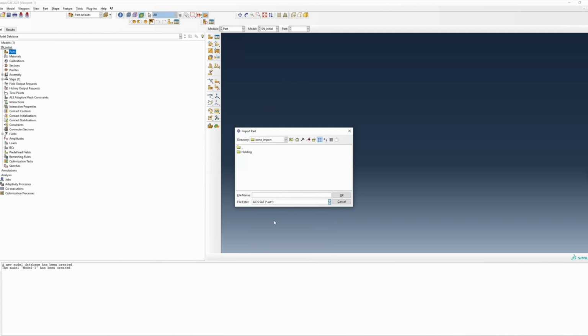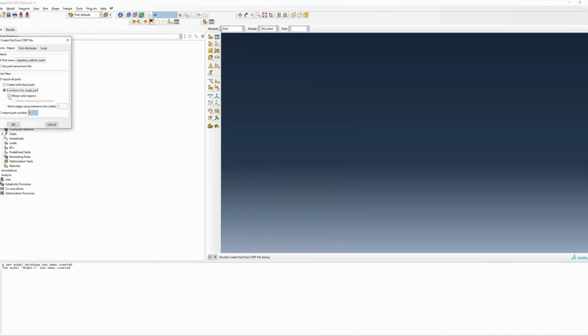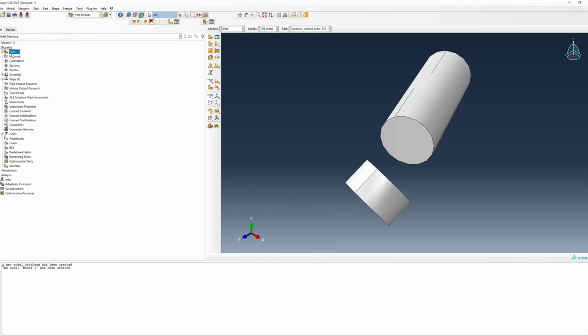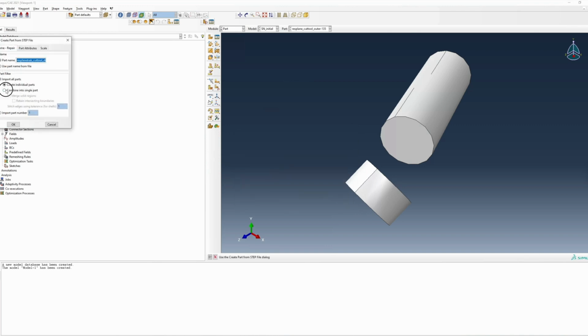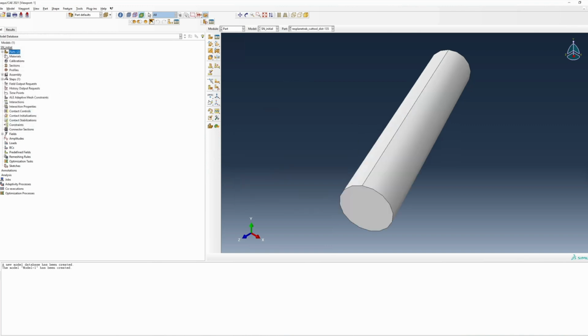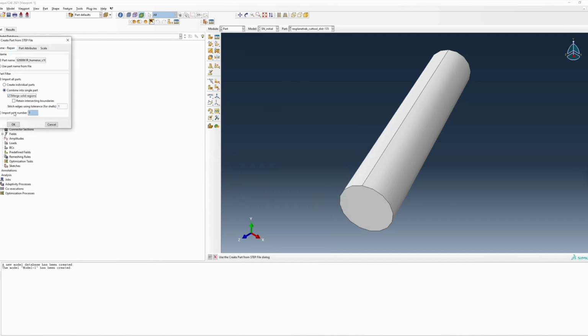To start off, just import your step files for your bone models as well as your cut tools. It's important that you use discrete geometry cut tools in Abaqus directly as opposed to performing your resections in SolidWorks, as those resections become much more compatible with the software. It is of course possible to perform these resections in SolidWorks itself, but it's highly not suggested.